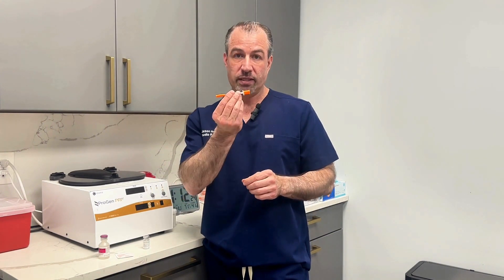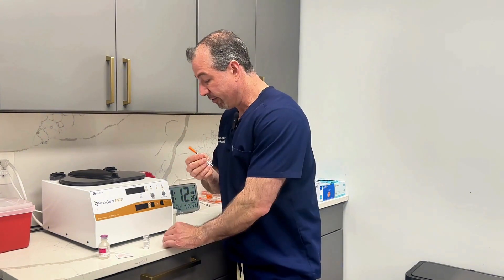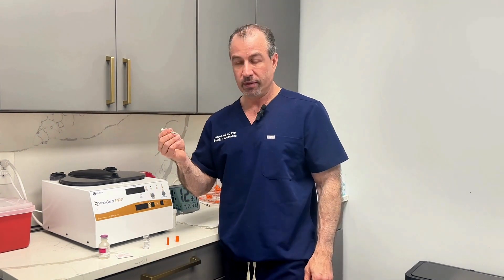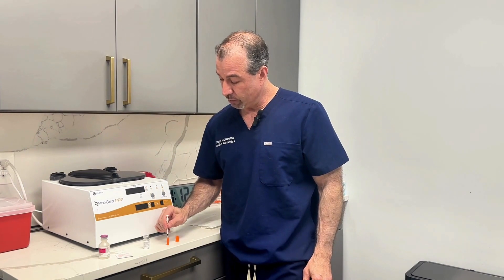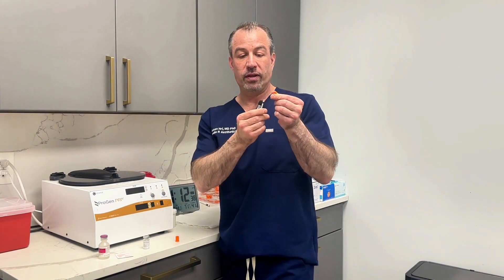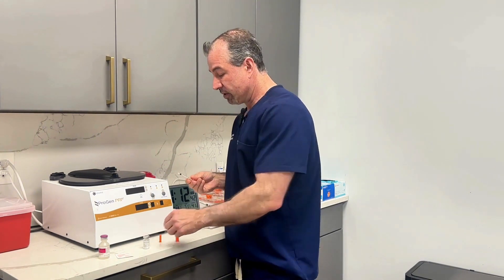The needles have two plastic caps — you're going to take both ends off. We like this design because this cap you can put like this, and when you want to recap it, you basically just come down here and recap the needle. The reason you don't want to recap like this is if you keep doing this, you're eventually going to stick your finger. Take those off.